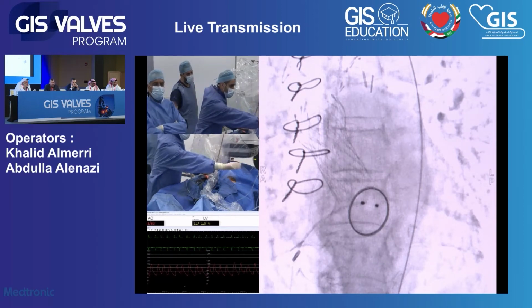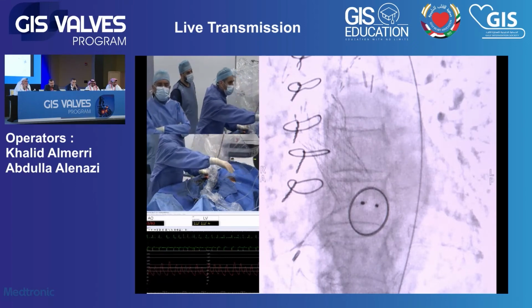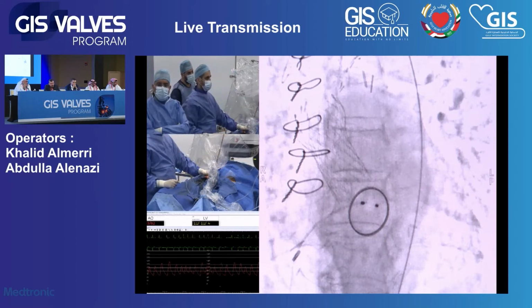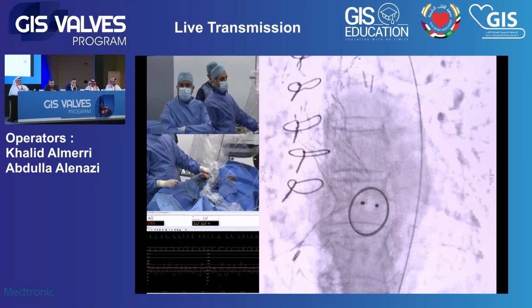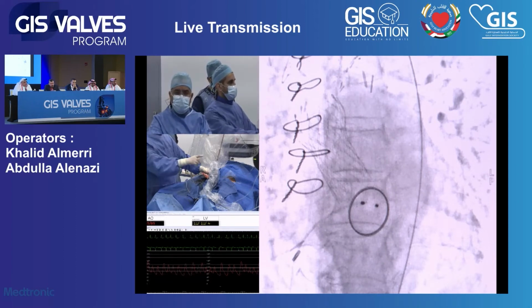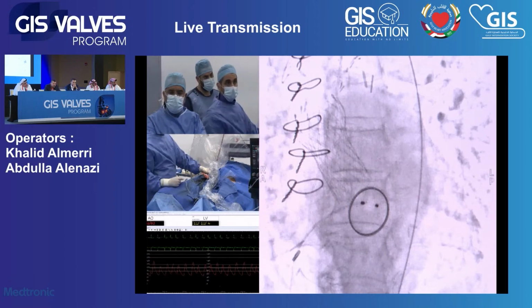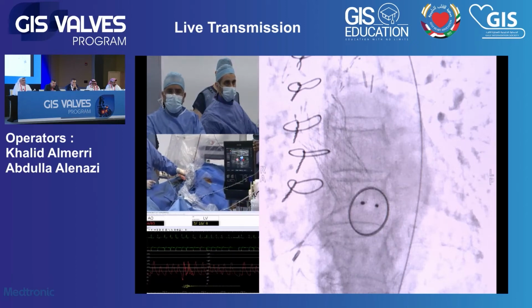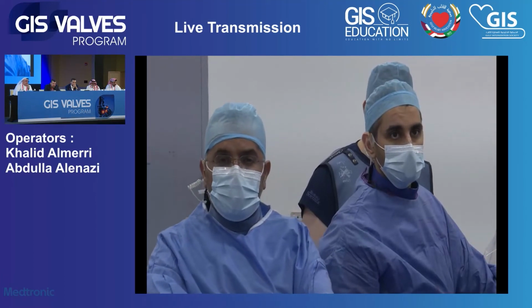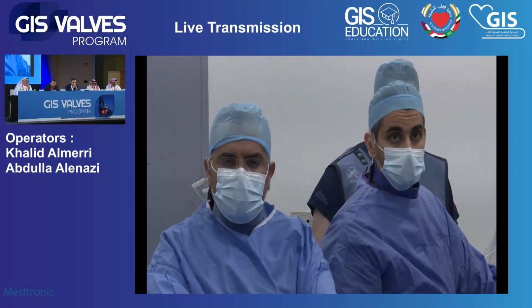Just one quick comment on AR. Basically, we have to be realistic with the patient's result. Our aim is to get no AR or trivial AR, and we do our best to achieve that result. But sometimes you get an elderly lady or man who has limited mobility and functional status, and lots of calcification, and you end up with mild plus, maybe moderate AR. In some situations you may have to accept more than mild if the risk is higher in patients.